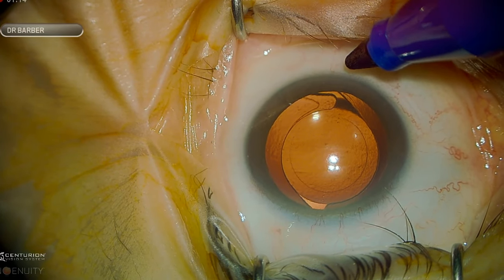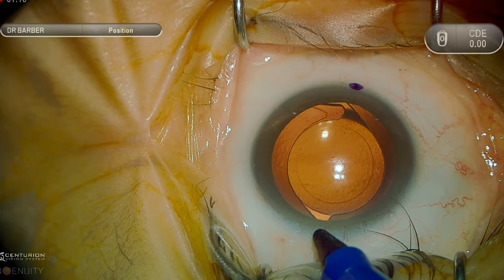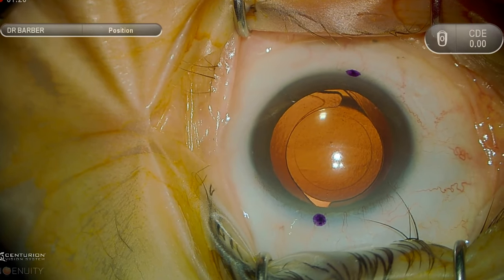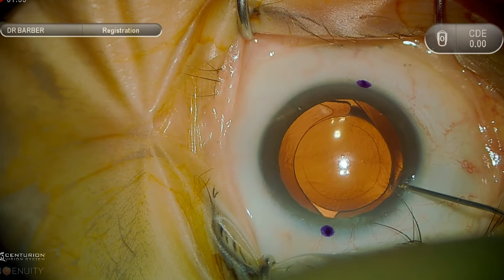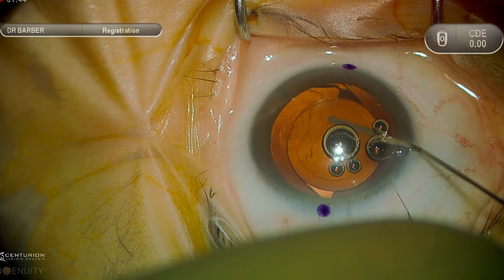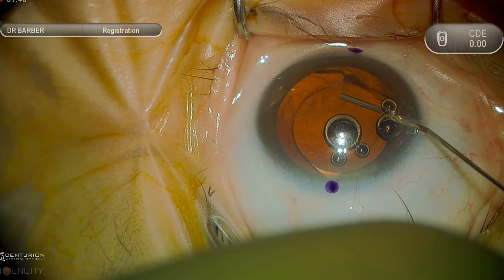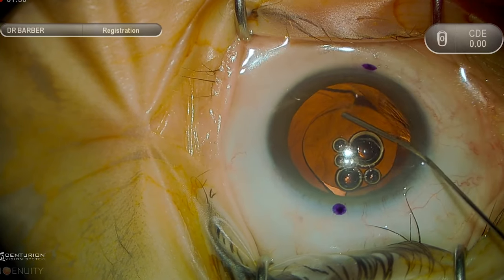This is a case of a simple intraocular lens exchange, which needs to be a skill that all anterior segment surgeons are comfortable with. This patient had LASIK approximately 15 years prior for a high grade of myopia and then underwent cataract surgery with the use of a toric intraocular lens implant. This is a single-piece acrylic lens implant manufactured by Alcon.